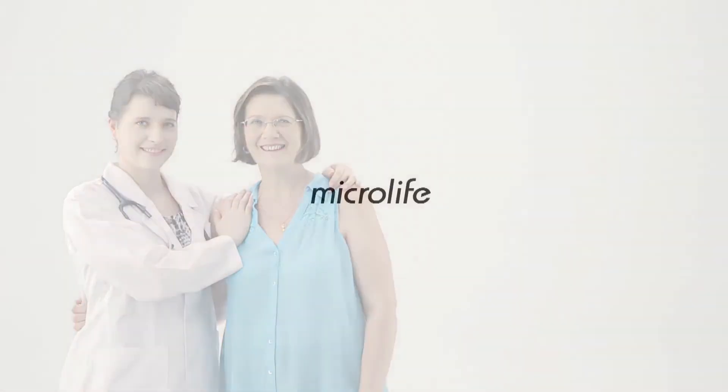MicroLife Watch BP Home A is your best choice for stroke prevention. MicroLife — a partner for people, for life.